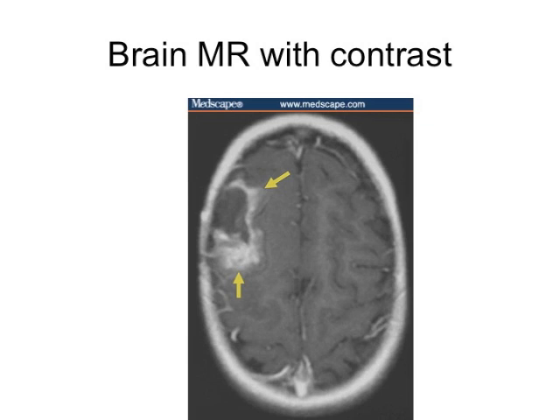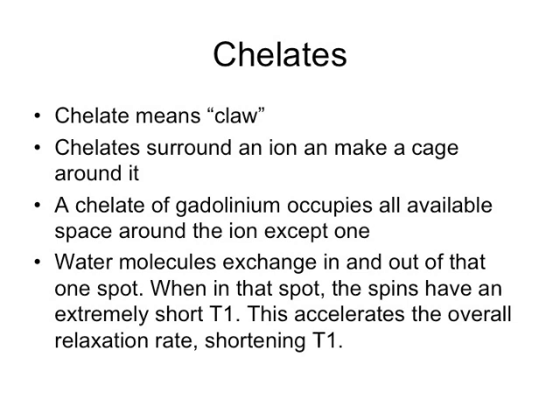Not on the brain MRI though. What you're seeing here, enhancement, is not the liquid itself. It is the effect that liquid had on the tissue. You're capturing that changing T1 relaxivity. That is not the liquid we injected.